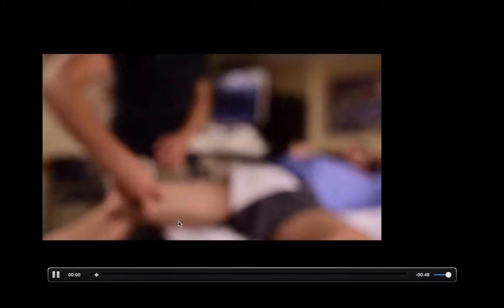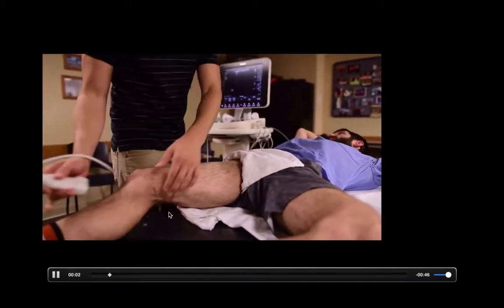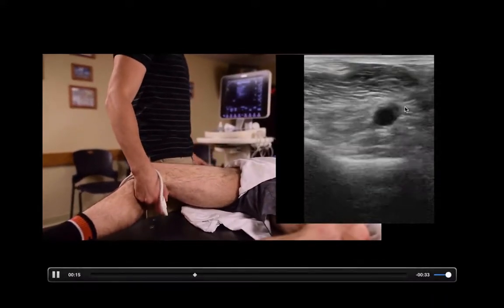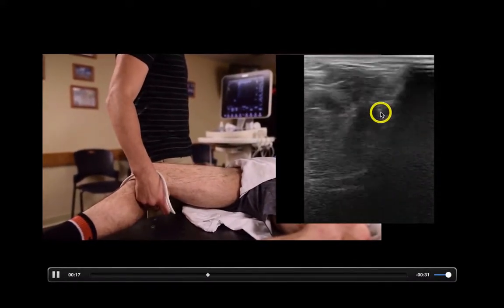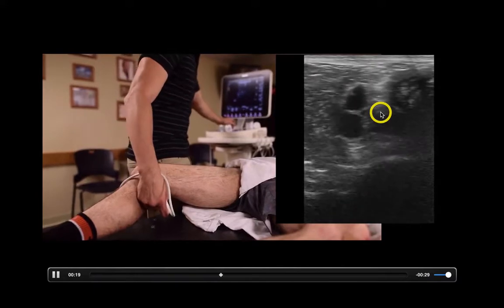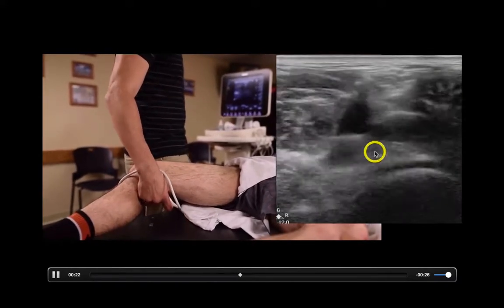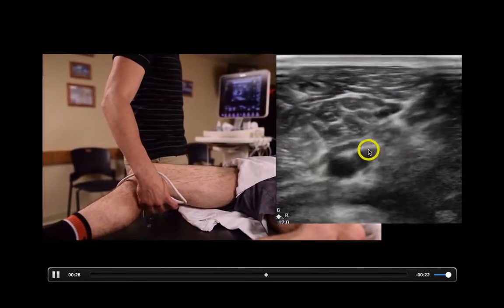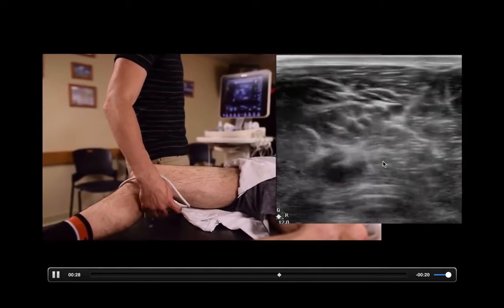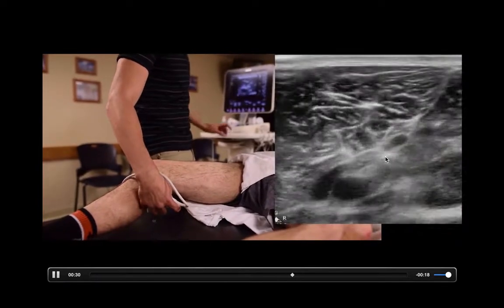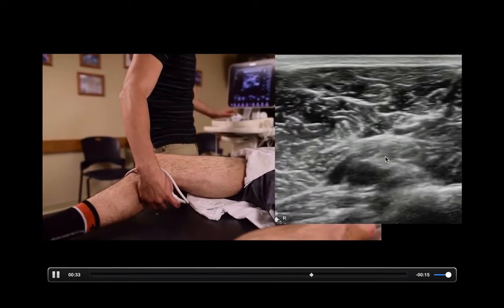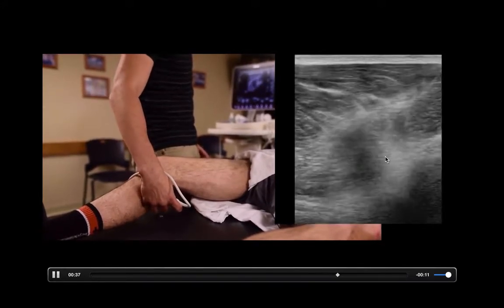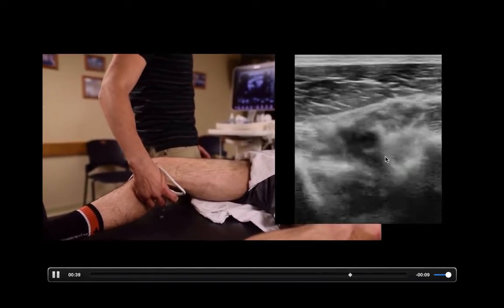You can actually have the patient bring up their leg right there — it makes it a little easier to bring the probe down there. Here is the popliteal vein, and you can see that I'm finding it and then at one centimeter increments I am compressing that to make sure there's no clot in that popliteal vein. Right there you can see it actually starts splitting into the calf veins. I'm following those down basically as far as I can follow them. The calf veins are pretty difficult to evaluate, but you still can — go down as deep as you can and make sure there's no clot in any of the veins down there in the calf.